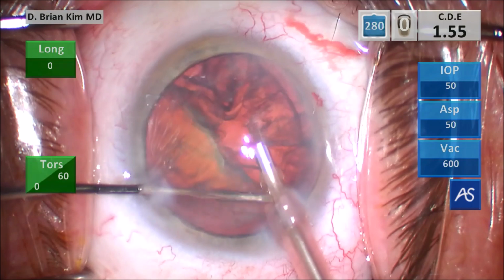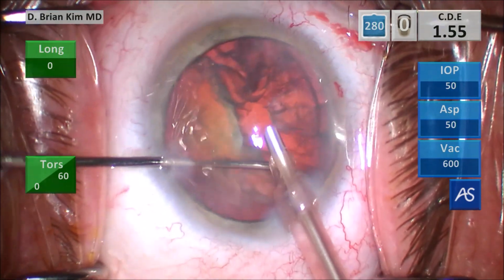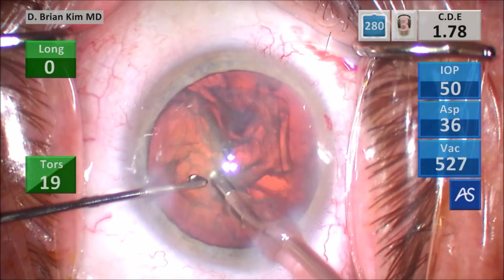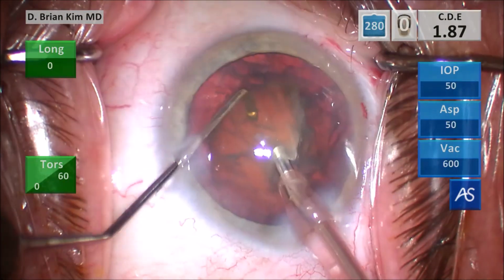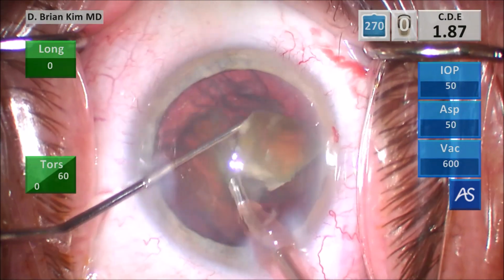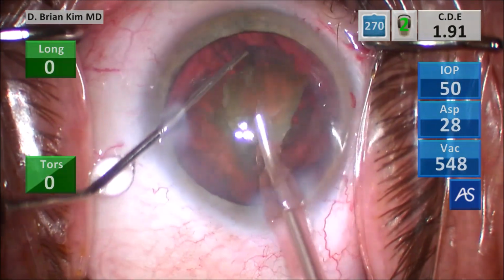Very carefully, I'm trying to turn the lens. It doesn't really want to turn, so I'm going to try to grab it and lollipop it and lift it up a little bit. In this case, it's okay to use a little bit of vacuum and ultrasonic energy to impale that lens and then rotate it up versus trying to spin it.